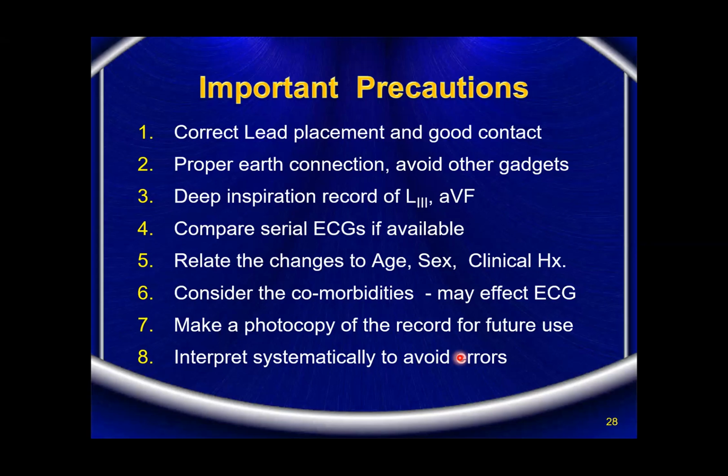Preferably mobile phones are out of the room when you are using the ECG, because each time the electrical impulse comes into the mobile phone, there could be a disturbance. Many a time we forget this. So we keep our mobile phone on the table and start recording, we see a lot of disturbance, we wonder what is happening, we adjust the leads. The moment I keep the mobile phone out of the room, my problem is solved. So this is a practical point.